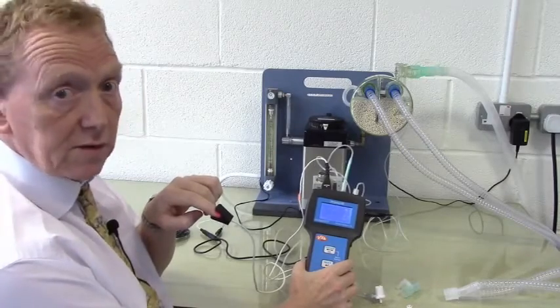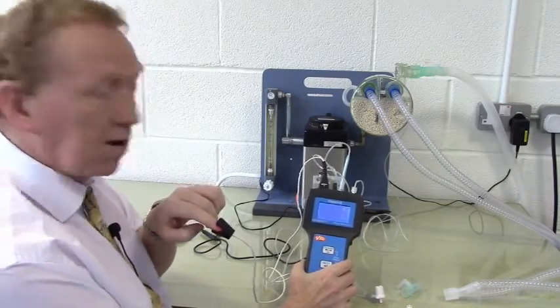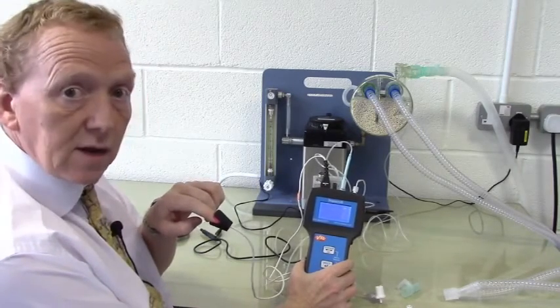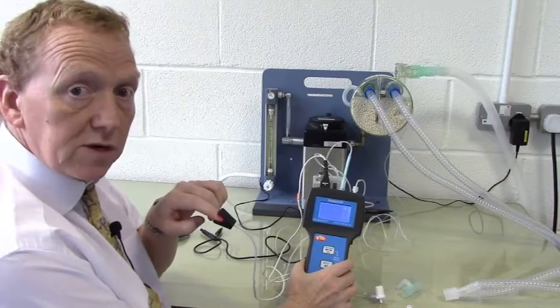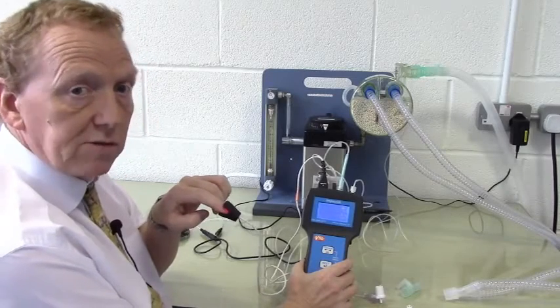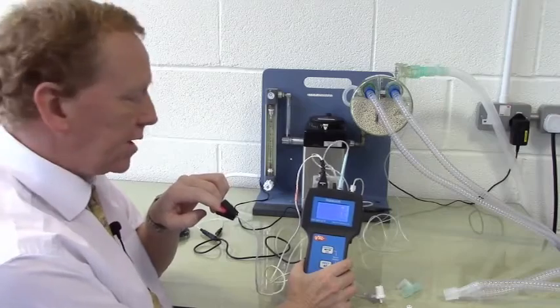The waveform is displayed on the screen and shows 98% and a heart rate of 69 with an A confidence rating. The confidence rating is A, B or C, A being confident, B being questionable, and C being unreliable. If a B or C reading is obtained, then you should move the probe to obtain a better reading.